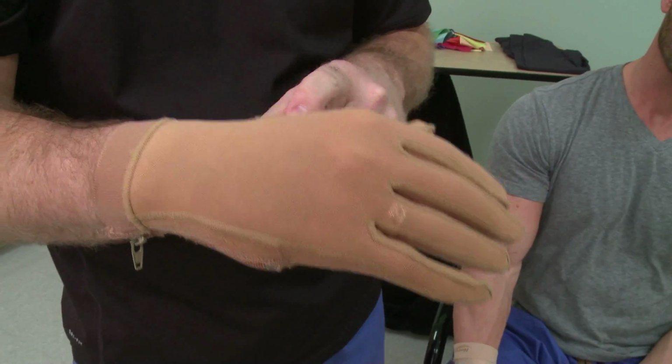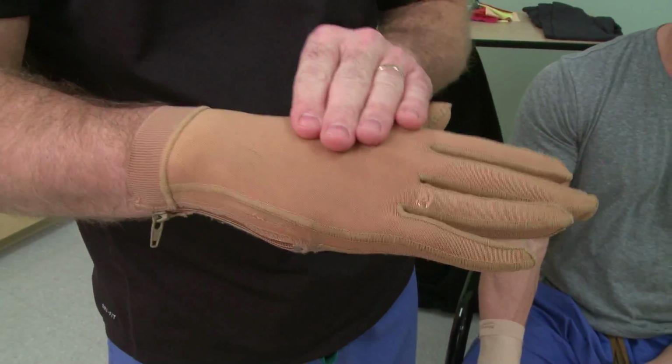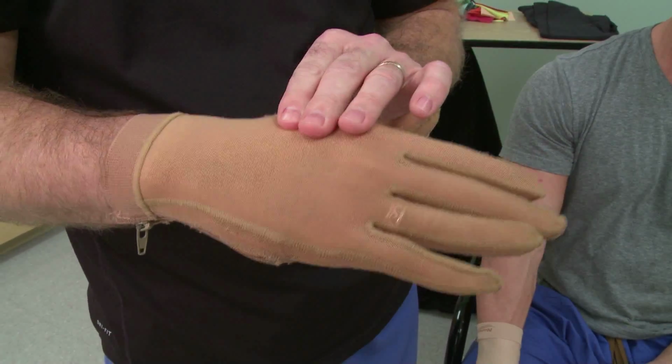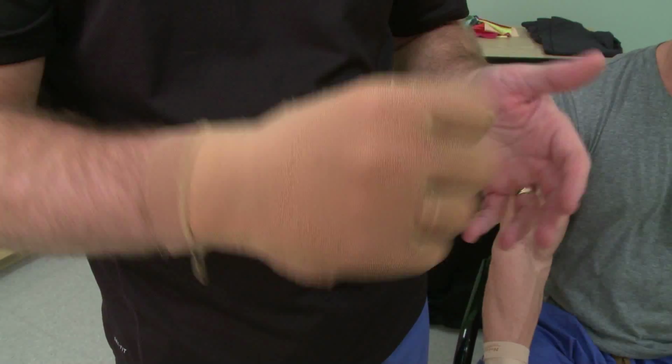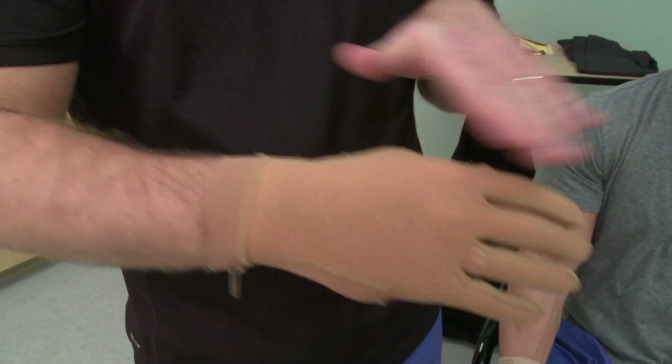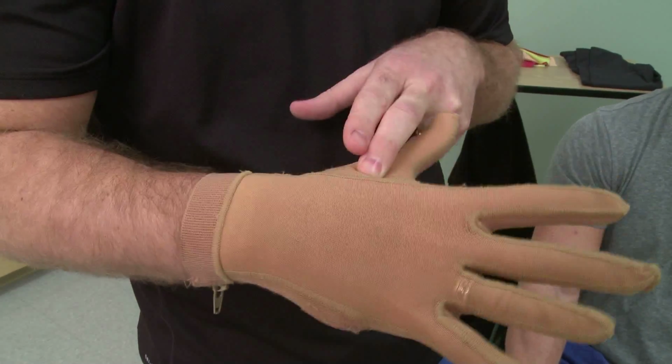As you can see, custom fit compression is not quite as stretchy as some of the compression that you initially leave the hospital with. It's tighter to push down onto the scar tissue to help reduce swelling and to reduce scar tissue buildup. It also provides a layer of protection for you to function in the outside world until your skin is durable and strong enough to serve as that outer layer of protection. Compression is worn to help reduce swelling and to reduce scar tissue buildup. It also serves as a layer of protection in the early stages of recovery from burn, skin grafts, and wounds.